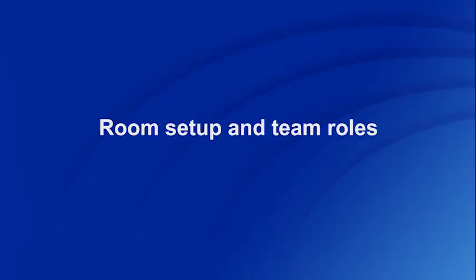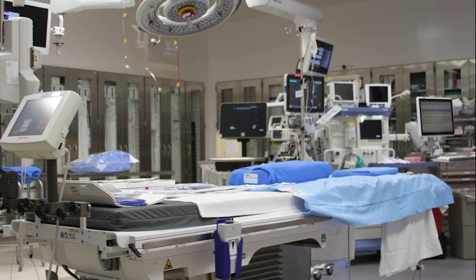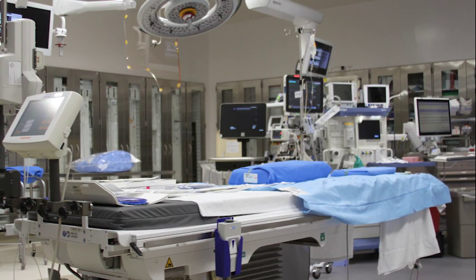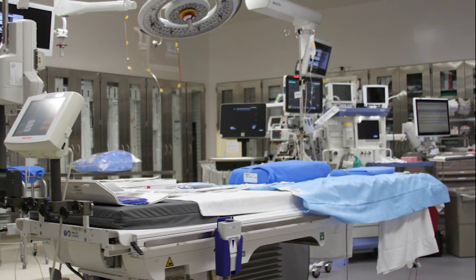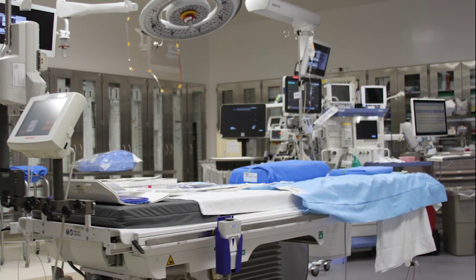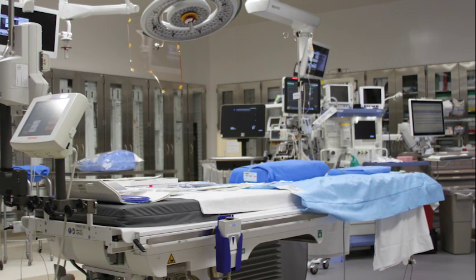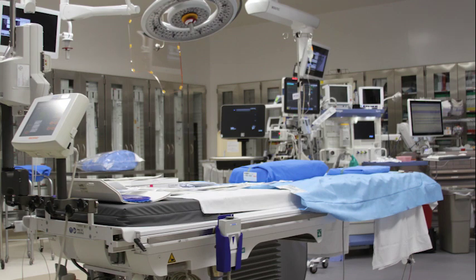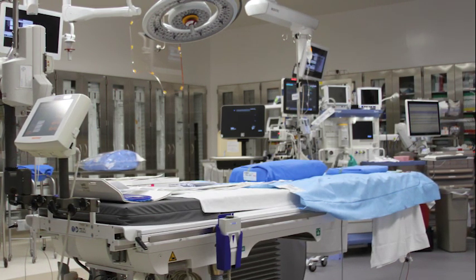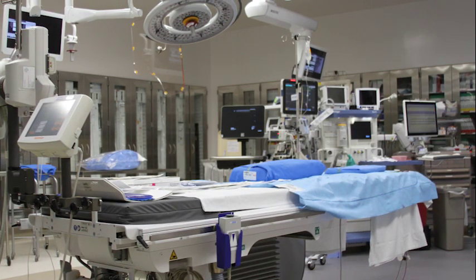Room setup and team roles. The procedure room should contain a fluoroscopy table, portable or wall-mounted C-arm fluoroscope, fluoroscopy monitors, and a power injection system that will enable digital subtraction angiography. Patient monitoring equipment is necessary to assess vital signs during the procedure. A ventilator is required for patients receiving general anesthesia. Finally, the IVUS tower and monitor will be needed for IVUS imaging.